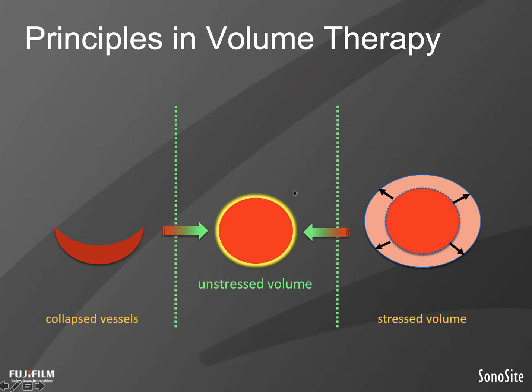Thus, we have to establish unstressed volume, and this volume status varies very quickly, so it's very important to assess individual volume status at different times individually.